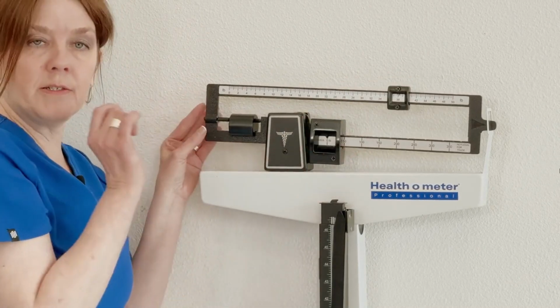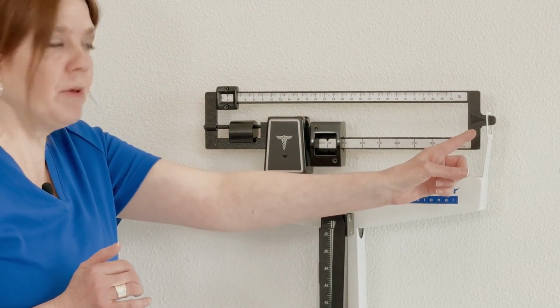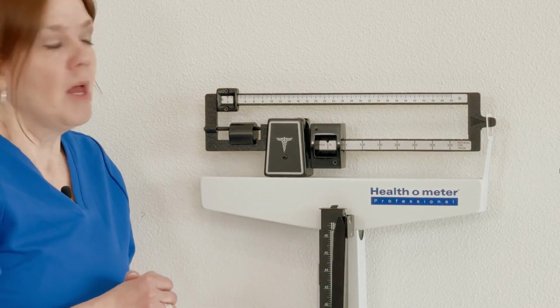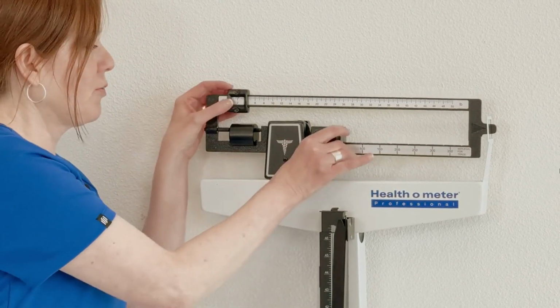When you go to stand them on the scale, after it's on 0, the arrow will be floating in the metal square. And I want that just to be there on 0 so that when the patient stands on the scale, everything's ready for them.